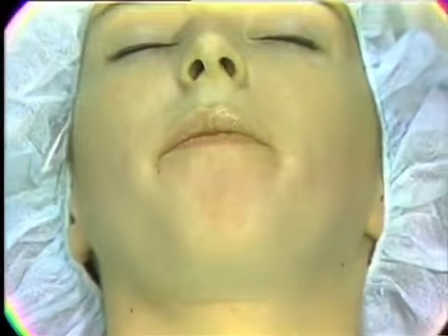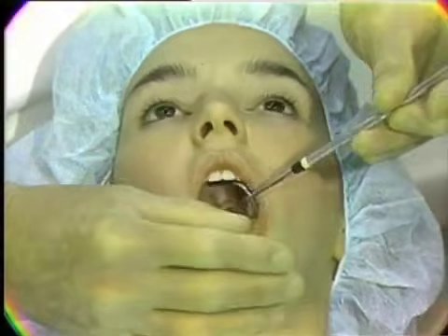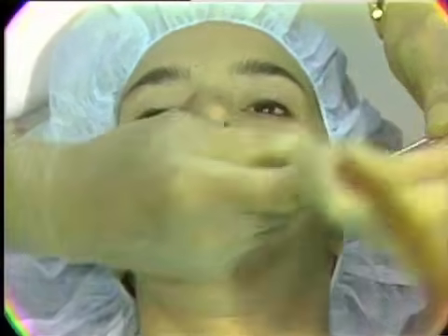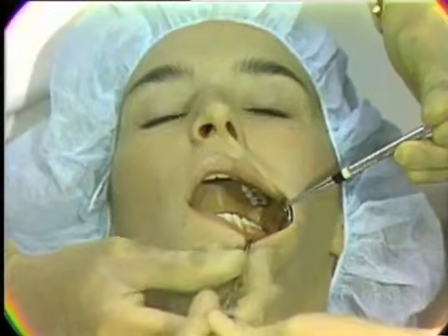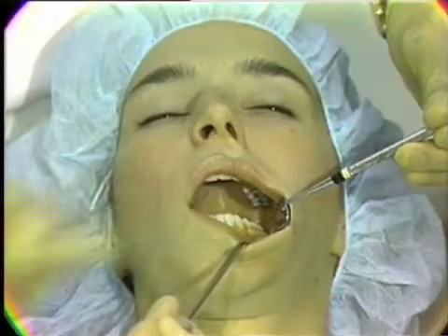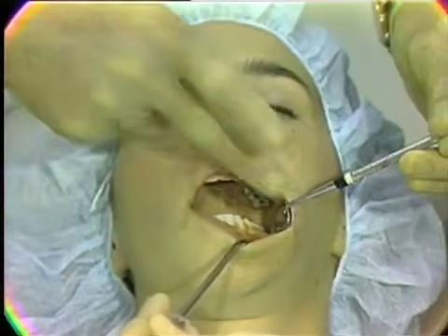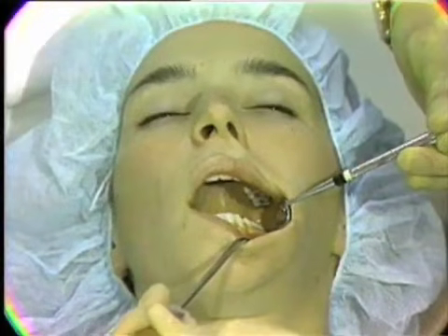As the assistant retracts the cheek, it is well to keep in mind that the position of the head must be maintained and light must be established into the field, so often the suction tip can be used to retract the lower lip downward to allow more light to gain access to the field while the mirror is being used to retract the cheek.